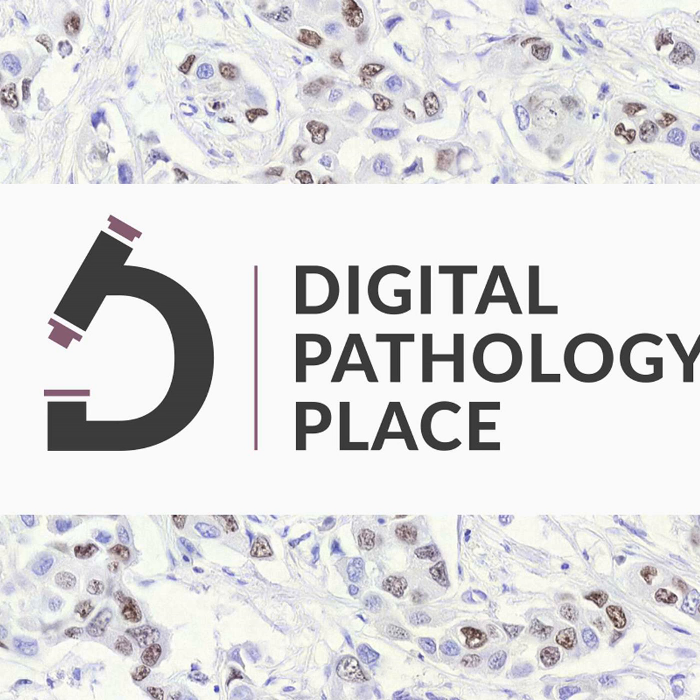And you could also have this multi-headed microscope option, or conference is what we call it. You could have multiple colleagues log in. One person could be the driver, and it's just like you're all sitting in a multi-headed microscope. One person's driving and maybe narrating and showing different features of a slide or a scan, and then you can pass the pointer to another person who has noticed some other feature that they want to speak about, and use that to kind of share information. We've had this for years, but especially with COVID, where people are more remote, this would allow people to really interact more easily, simulating a multi-headed microscope.